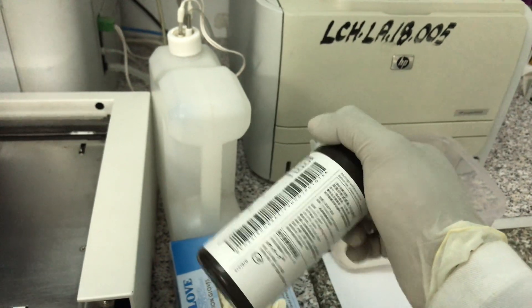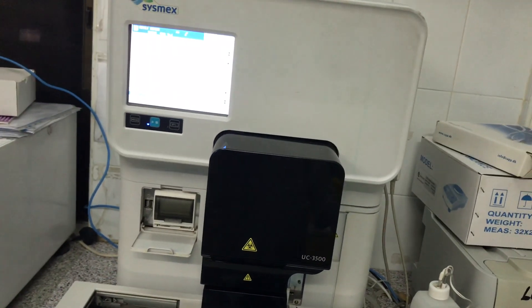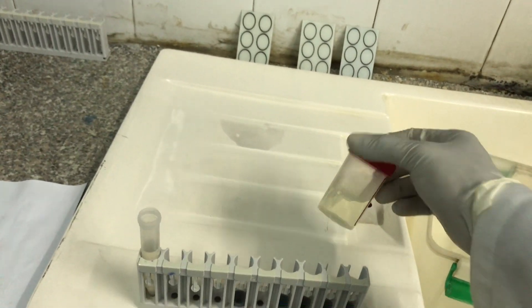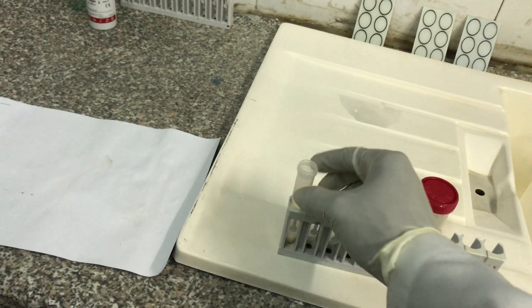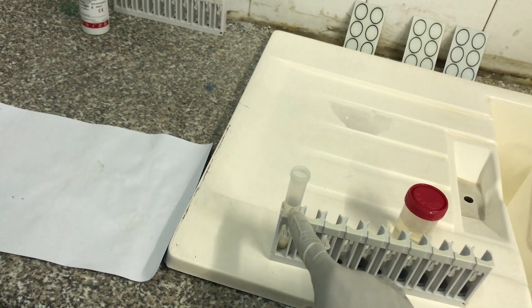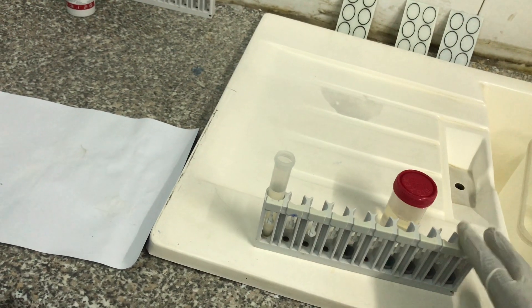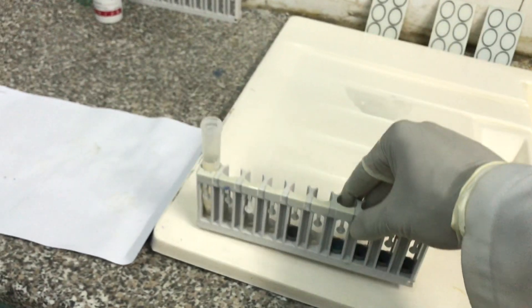The strips come in this form that you feed into the machine. So basically, if you want to run a urine sample, what you do is take your urine sample — as you can see in this container — and then dispense an amount into your sample tube. Make sure that it's filled above this level, as you can see here.